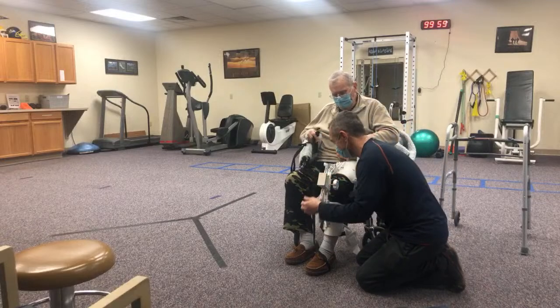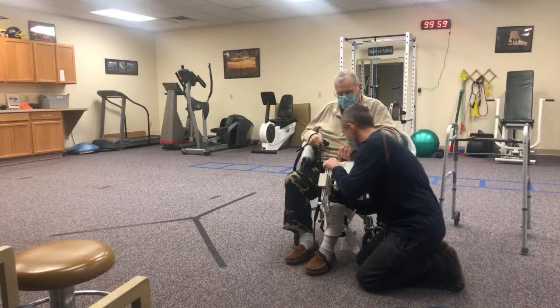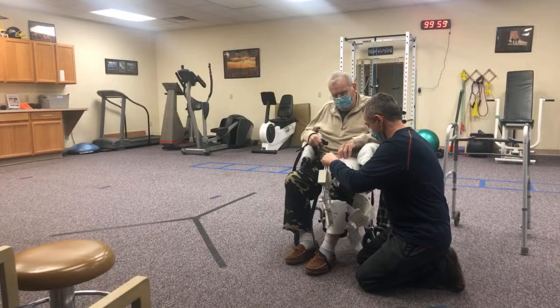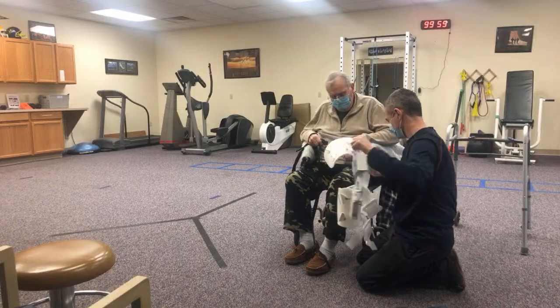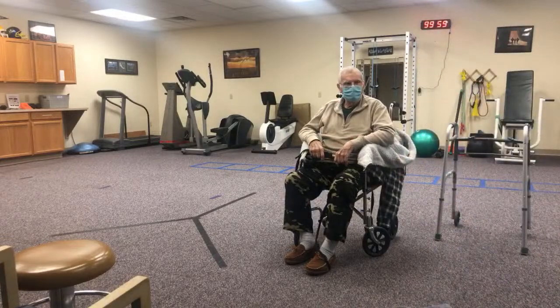It's like a pressure release valve. All right, let's get that guy off. All is good in the world again.